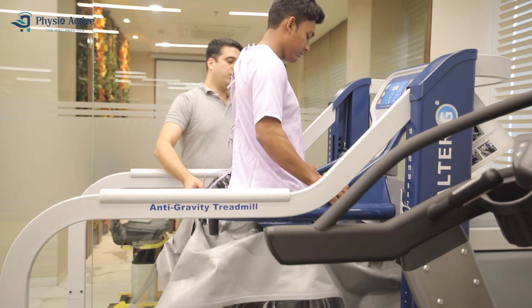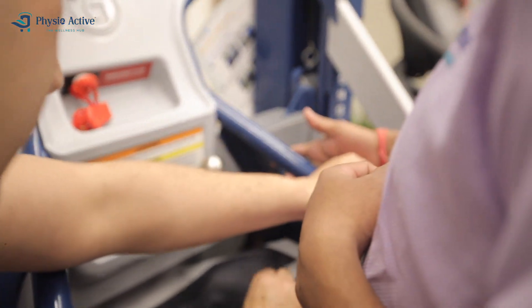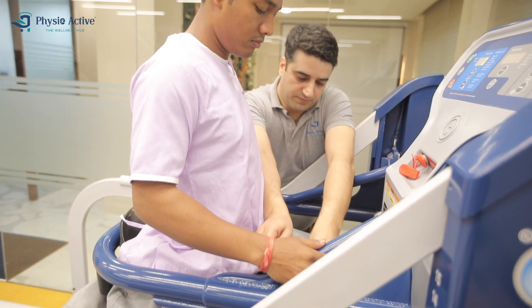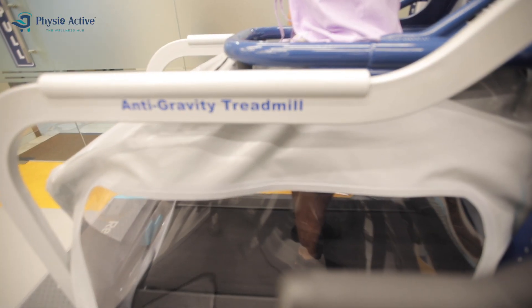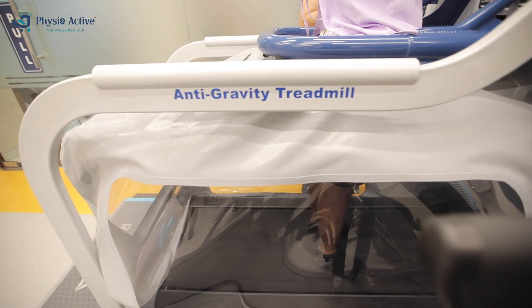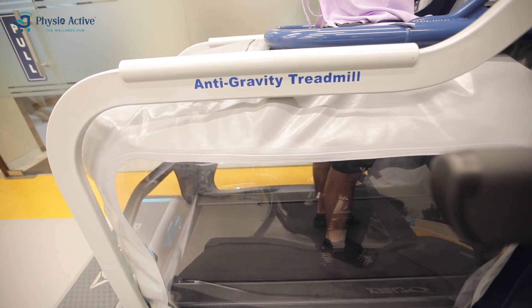Alter G anti-gravity treadmill is ideal for treating patients with pain like osteoarthritis, knee and ankle foot pain, or athletes recovering from injury or surgery. It can be used to train with reduced pain.